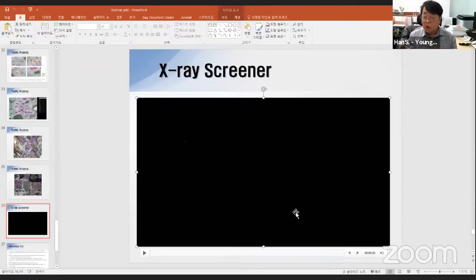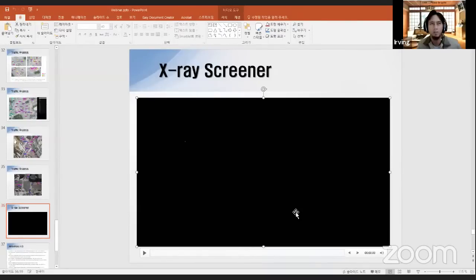analysis, because an object is usually defined as separate and small, and it has a distinguishable boundary. But in medical images, it is hard to separate the object from the background or other organs inside the human body. So generally, people use image segmentation instead of object detection for medical image analysis. Okay, so we use image segmentation.